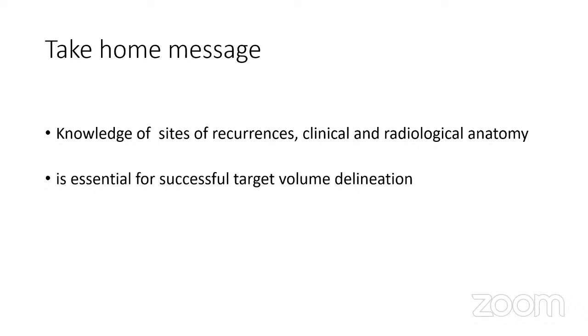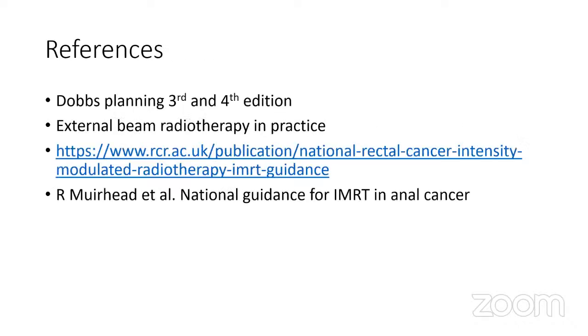Then we need to identify what structures are there. So we need to know the clinical anatomy as well as the radiological anatomy, which is very much essential to be successful in target volume delineation. So with this, I complete. These are my references from which I have taken the material, and thank you.